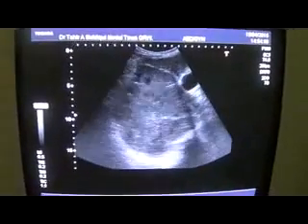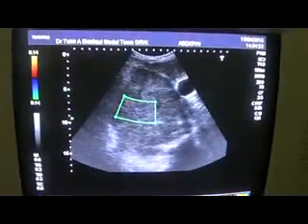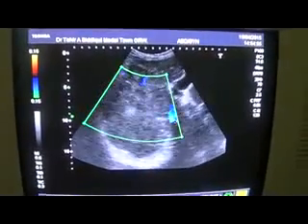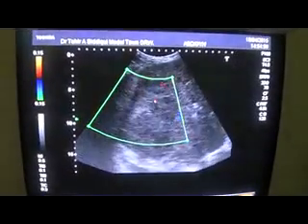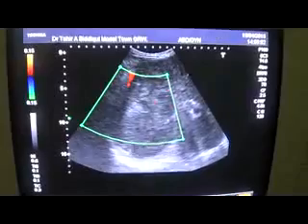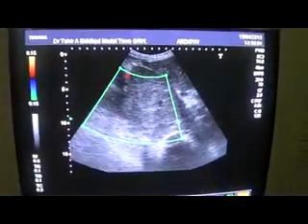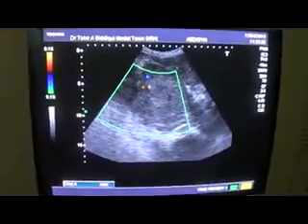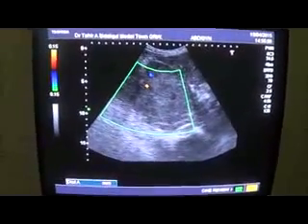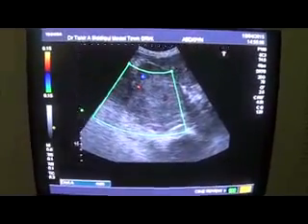So this is the mass — I am showing you the total mass. The mass does show vascularity. You can see the vascularity within the mass, both arterial as well as venous. This is the venous component and this is the arterial component.